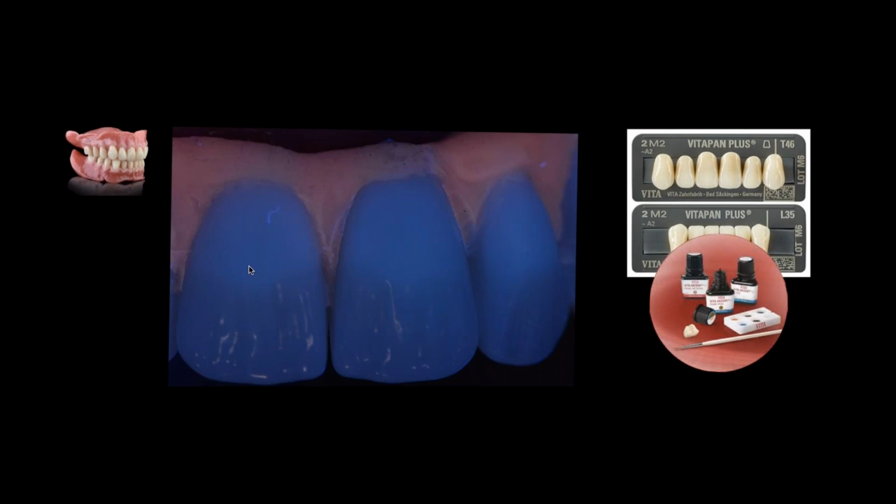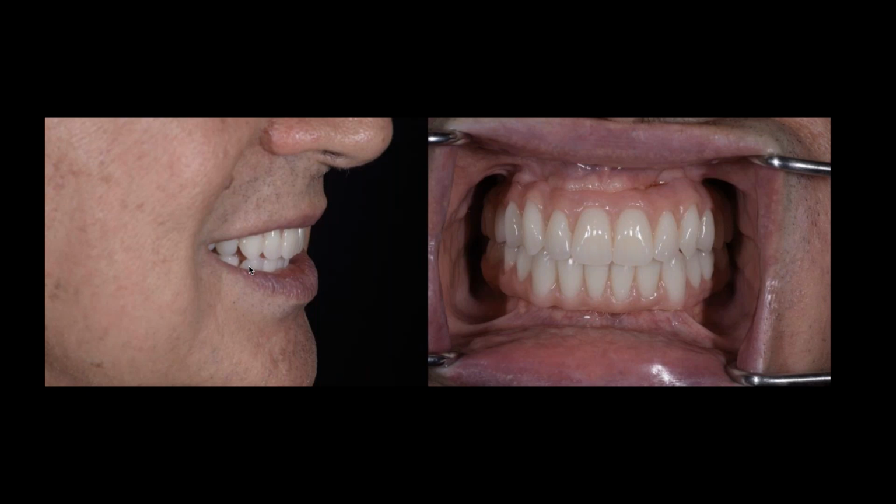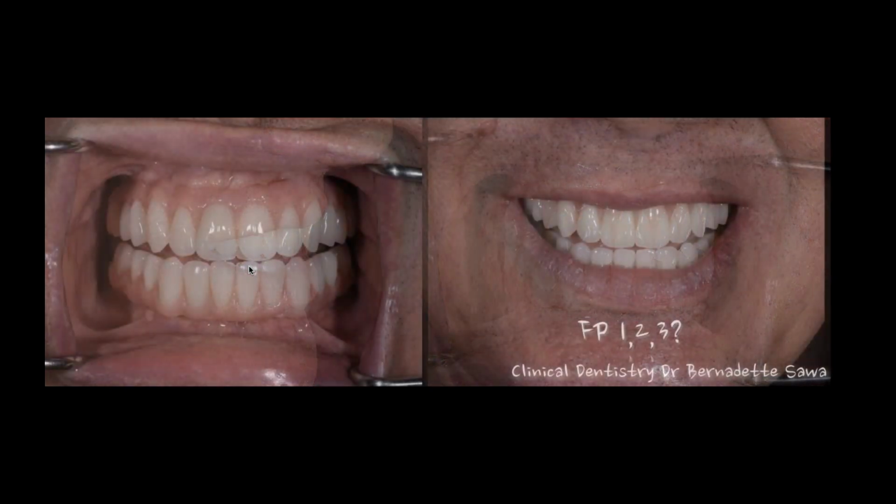And if I don't like the teeth exactly as they are, I'm free to modify them, just like in crown and bridge world. I could sandblast the teeth. I can use some of the accent stains and add a little bit more chroma or some check lines, or increase the mamelons or increase the translucencies. So I really have some nice abilities in denture world that is still, to me, very aesthetic, and I think really important for us to make these look proper as we're working our way through.